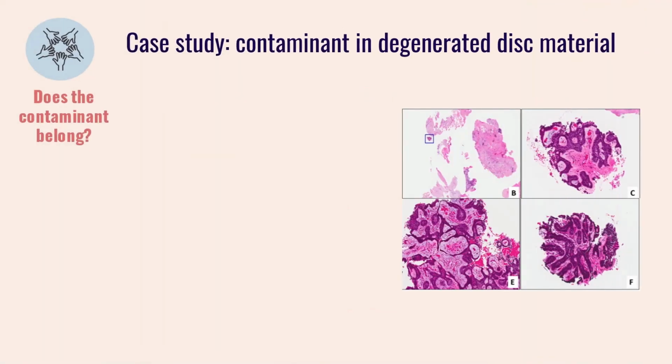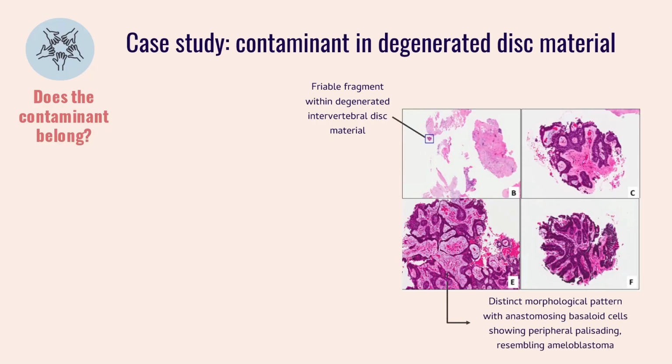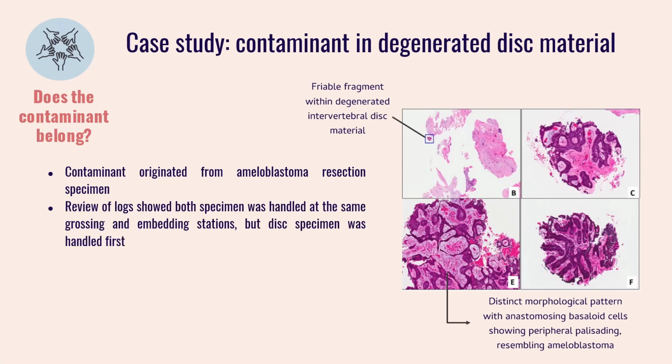This is a case of a degenerated disc material containing an unusual malignant fragment that was present in multiple sections and a short distance away from the main tissue. Upon closer inspection of this unusual fragment, we see distinct morphological features of anastomosing basaloid cells with peripheral palisading, which is reminiscent of an ameloblastoma. Indeed, this tissue was investigated and found to be a contaminant, which originated from an ameloblastoma resection specimen handled in the same grossing and embedding stations. However, review of the logs showed that the disc specimen was handled first in both stations. So how did this occur?